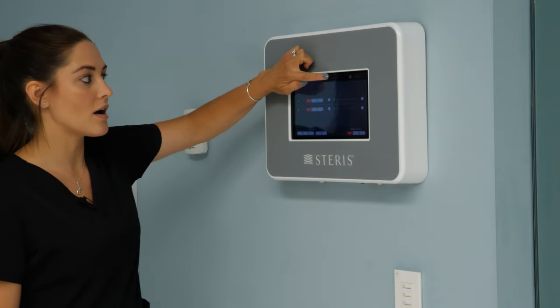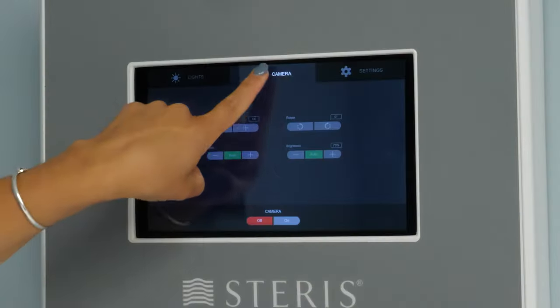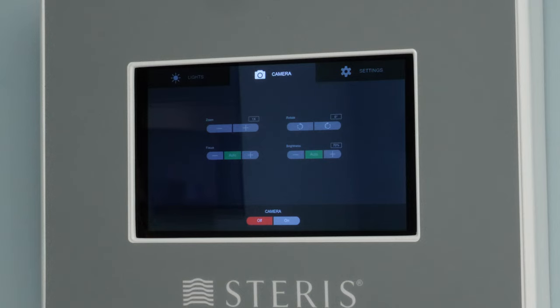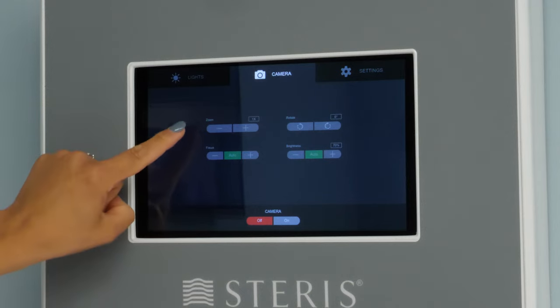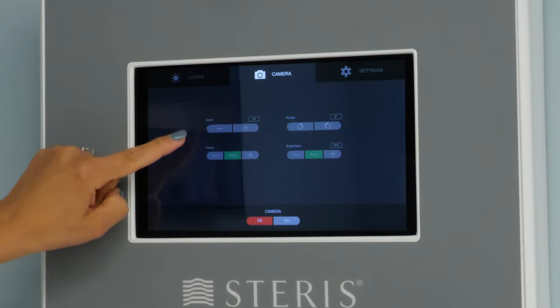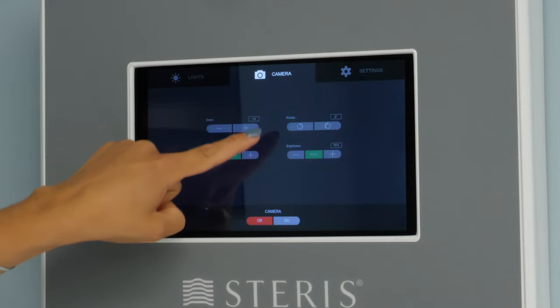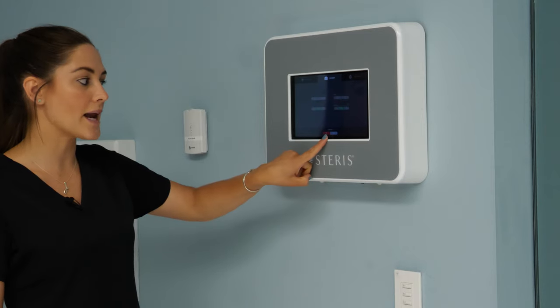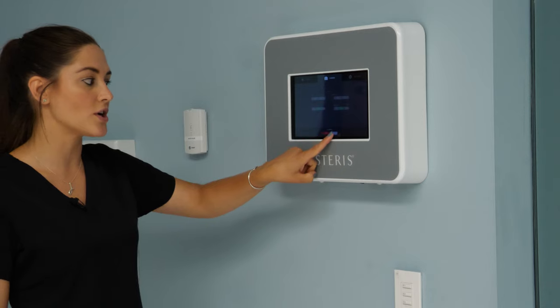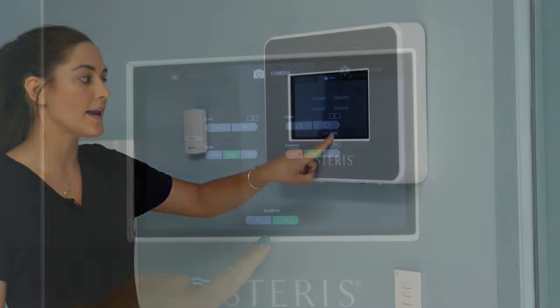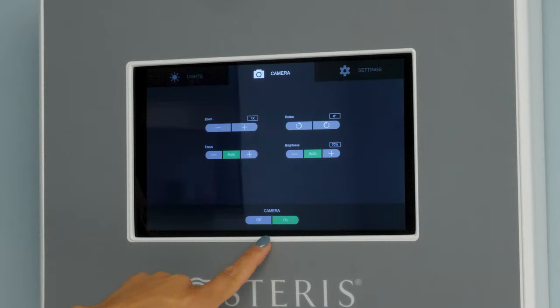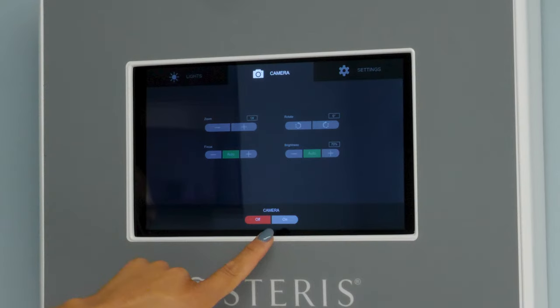The next tab along the top is your in-light camera tab. If you have an in-light camera in your system, this is one of the ways you can control the zoom, focus, rotate, and brightness. Down at the bottom is where you can turn your camera on and off.